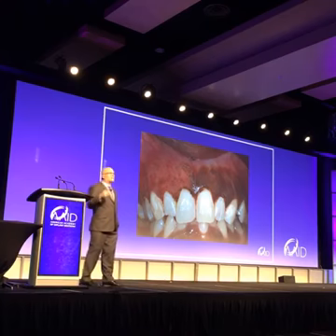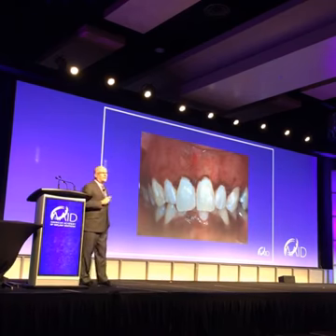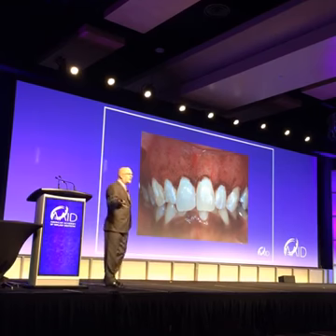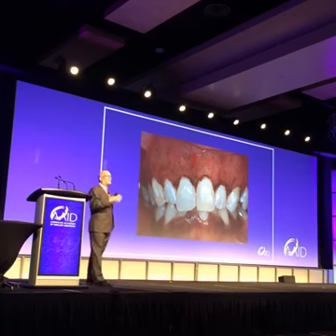Now I want to show this, why? Because it's just a nice contrast. But this is what she looked like right after. This is one treatment. What you're seeing here is the underlying tissue. Now, does it look burned? Does it look charred? Does it look dead? Does it look necrotic? No. It's healthy connective tissue underneath there.